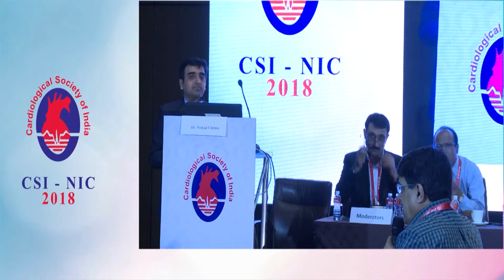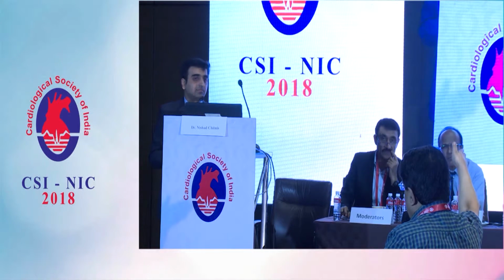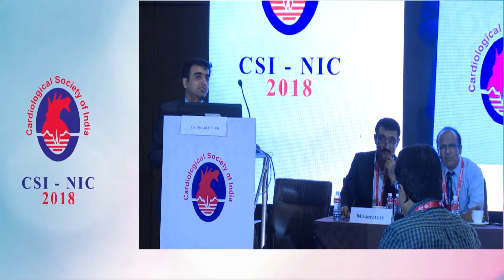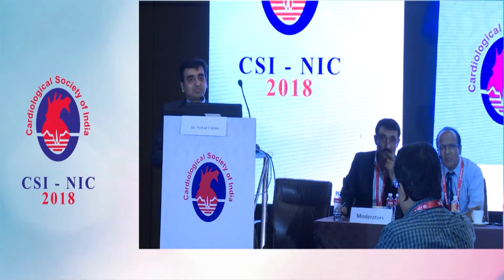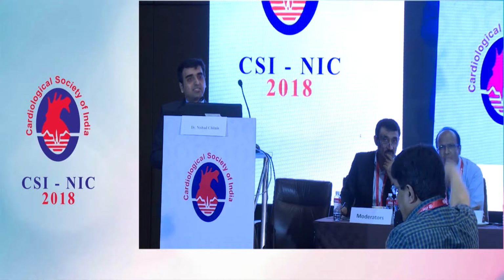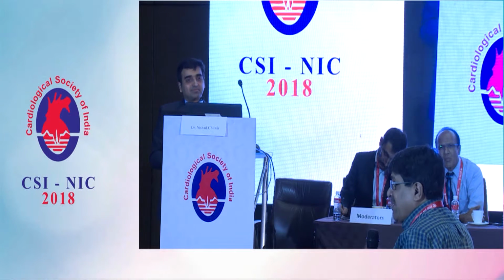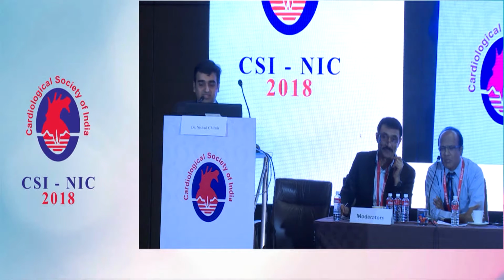And once you cross it, take another balloon there, deflate it, because if you look at it, once you were trying to pull out, your guiding was too deep into the stent. It is possible that you would have pulled out the stent also. It's quite possible. Second thing is you did not take an access with the other guide. Contralateral access should always be there. Thirdly, as you are pulling out, if you had the guiding with you, rather than pulling from the groin, first check what is there in the coronary artery, because many times you are busy in the groin because the balloon is not coming out, and you have created a problem there and you are totally unaware. So I think those standard things should be observed in all cases.